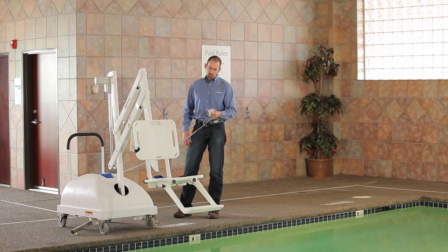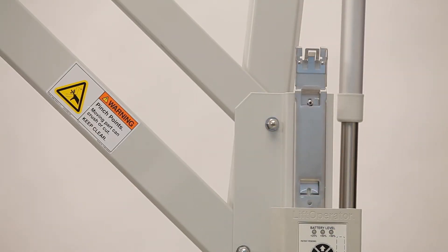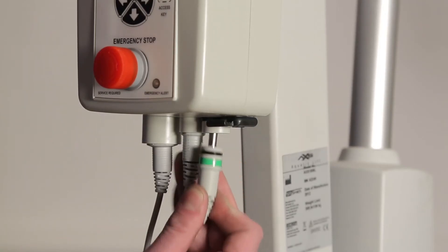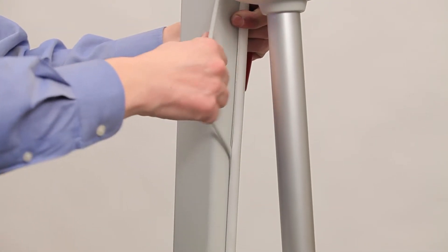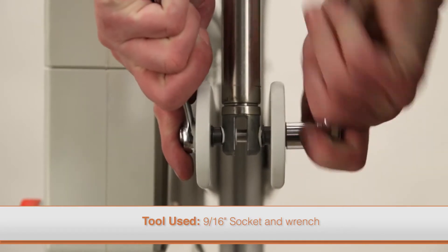Test all lift functions with both the touchpad control and the hand control to ensure that the lift operates properly. To replace the actuator, remove the battery and unplug the actuator cable from the control box. Remove the cable from the cable channel along the mast.